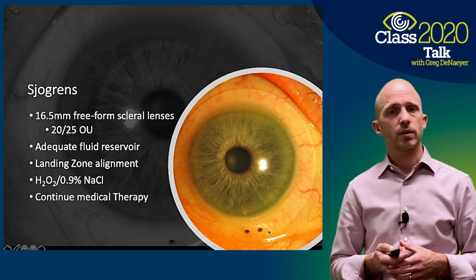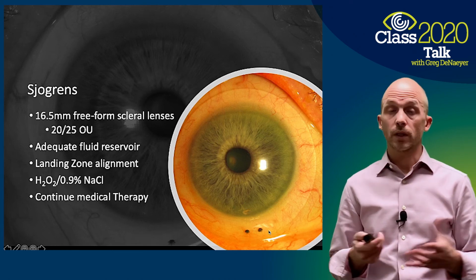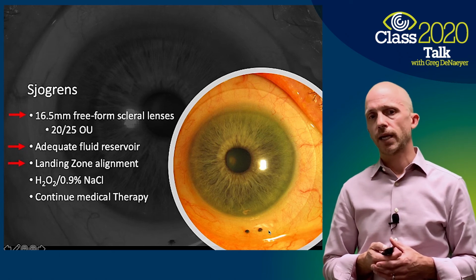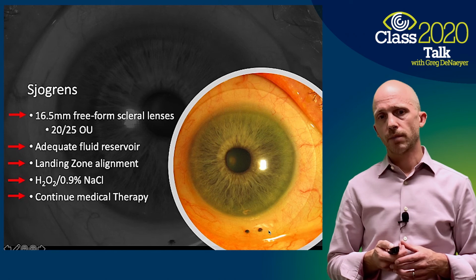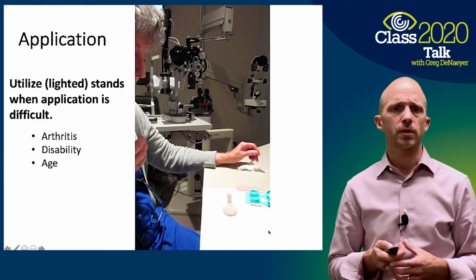I did fit her with 16.5 millimeter scleral lenses. Her visual acuity with the lenses was 20/25. Very nicely fit, landing zones aligned. She continues her medical therapy with her other ophthalmologist. So again, this is more of a co-management situation.